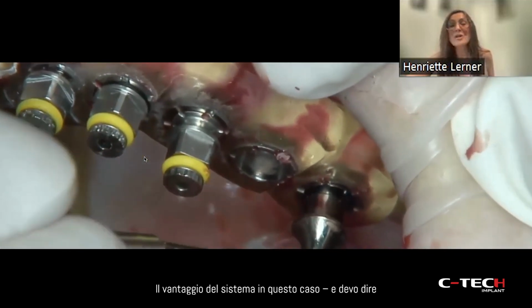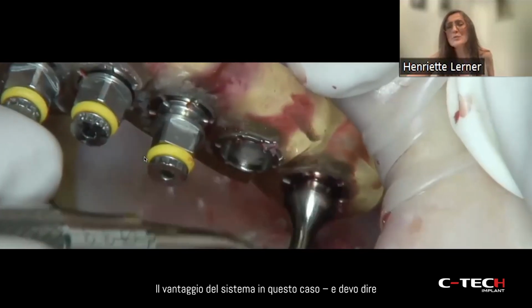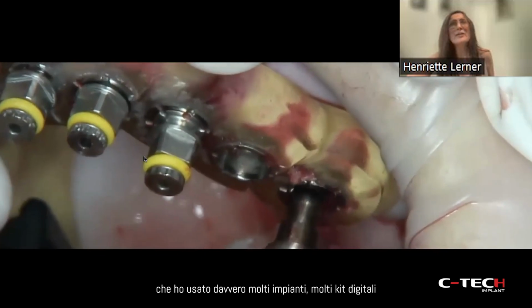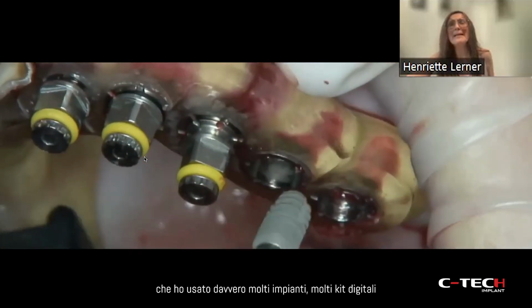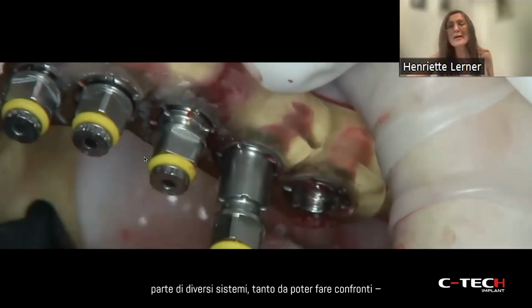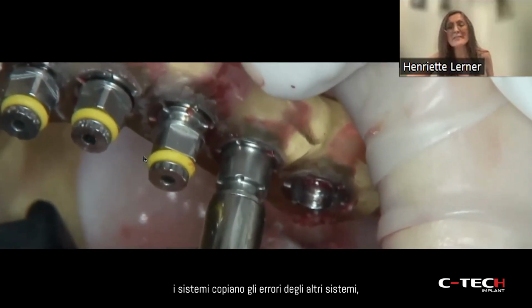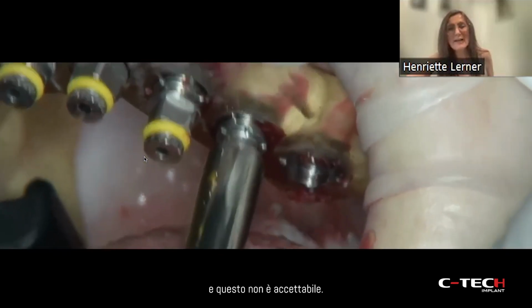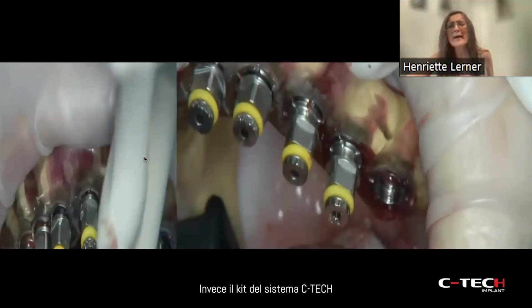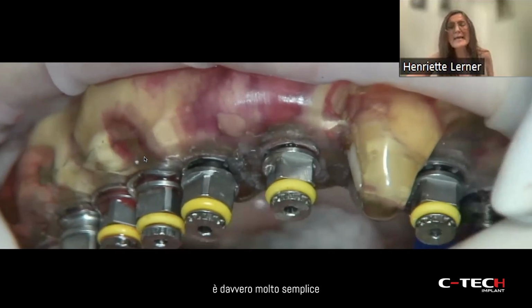The advantage of the system is, in this case, and I have to say, I used really many digital trays of many systems, and I'm able to do a comparison. And what happens mostly is that one system is copying the mistakes of the other, which is not allowed to happen. So this tray of the CTEC system is really very simple, having taken into consideration what the clinician needs.